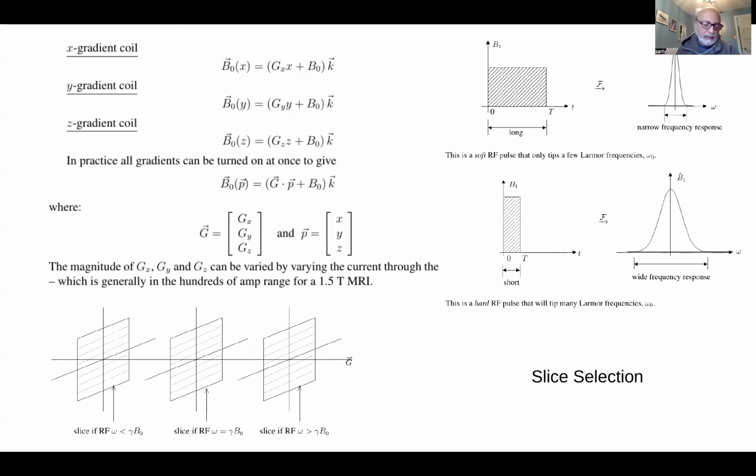There are other situations like flow imaging sequences and things like that, where you want to kind of hit everybody while you're trying to do some imaging, because you want to affect spins that are downstream in the blood from where you're imaging, and then you're going to image again to get some idea of flow. But those are advanced sequences, and for this, we're just going to cover some basic spin echo ideas here. So that's how you get slices.